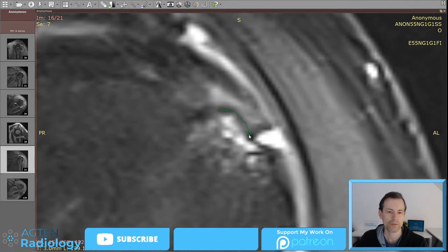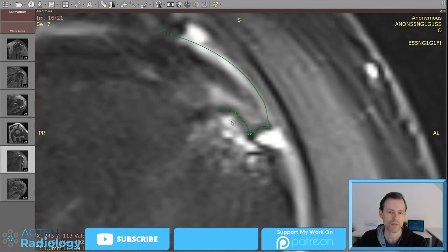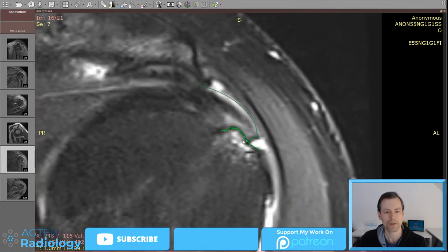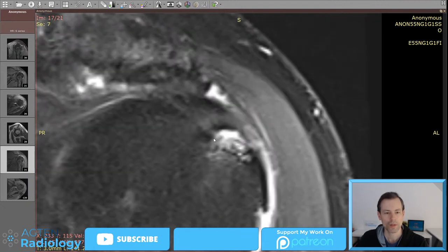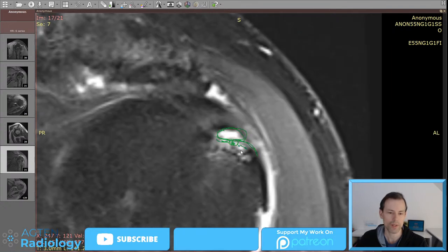We have tendon, some of it is attaching here, and this is like this. So basically, this is a tear, this is some cysts that are still here under the bone. So basically the bone plate would be something like this. Might be too big. Okay, and then we have the bone, with some subchondral cyst here. So this is again a tear, this one here, and this one as well, but here we have some irregularities. Now the question is, do they communicate?